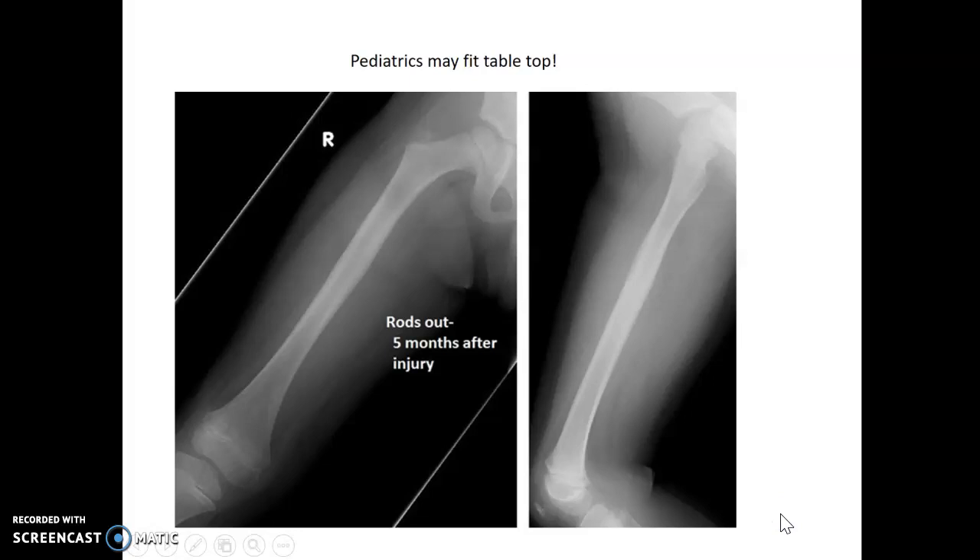For pediatrics, depending on the size of the patient, you may be able to fit them tabletop on your digital cassette going corner to corner and fit them on one image, saving them some exposures.